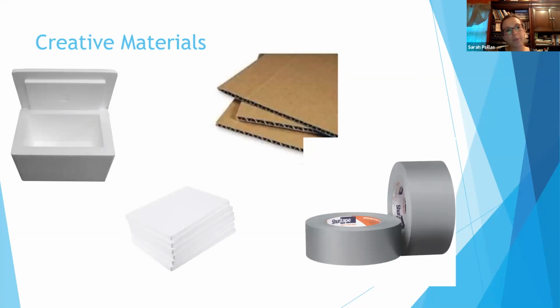Styrofoam is also great because you can cut it with a knife and cut it into any shape you need. Also, the thicker cardboard, more like a craft cardboard, is another great option because you can layer it and glue it together or tape it together.